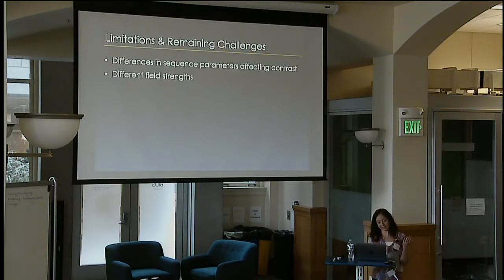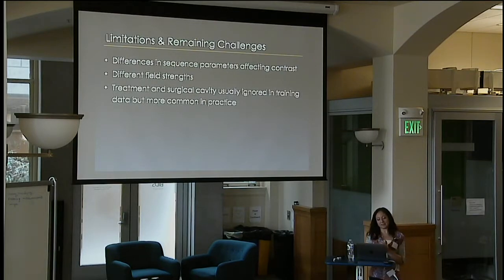You have different field strength scanners. You also have all of these data are based on your pre-surgical, before any treatment is applied. And then, realistically, most of your data is actually going to be after surgery that you're looking at. So, how does then that handle when there's a cavity, when the contrast and the lesion itself changes after therapy?